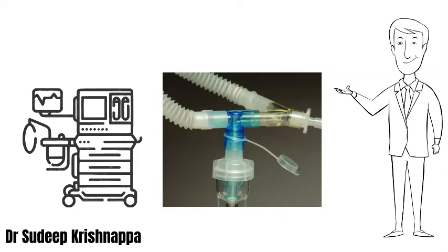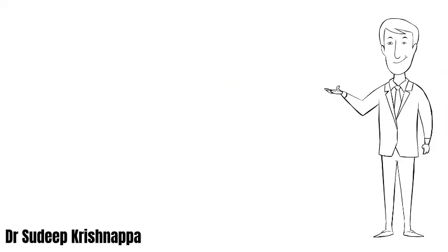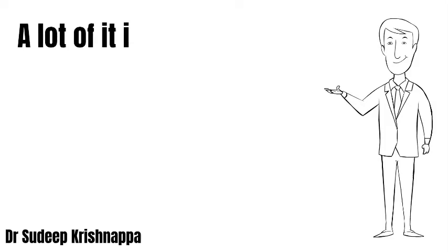These devices are in quite widespread use. They're used quite a lot, be it in the ICU, ward or OTs. But unfortunately, they have a lot of wastage. Because the process of generation of aerosolization is driven by high flows as well as continuous, a lot of the aerosol is wasted, especially when the patient is not breathing in, either when the patient is breathing out or in between breaths.